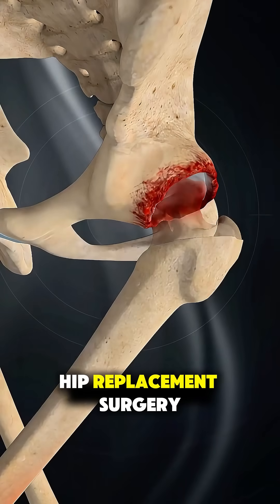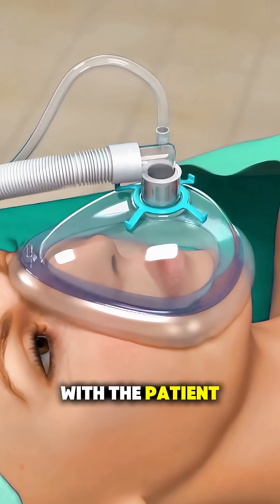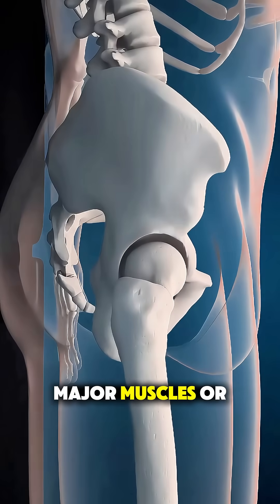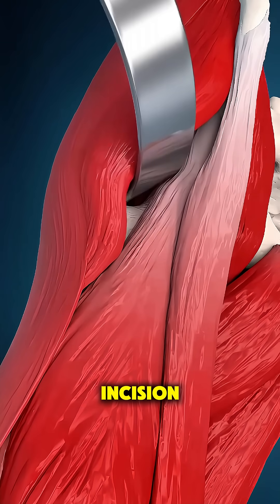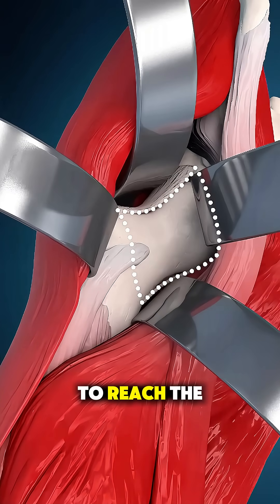Ever wonder how SuperPath hip replacement surgery is performed? It begins in the operating room with the patient comfortably under anesthesia. Instead of cutting major muscles or tendons, the surgeon works through a small incision and gently separates natural muscle pathways to reach the hip joint.